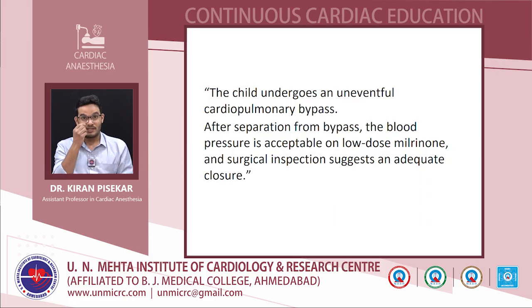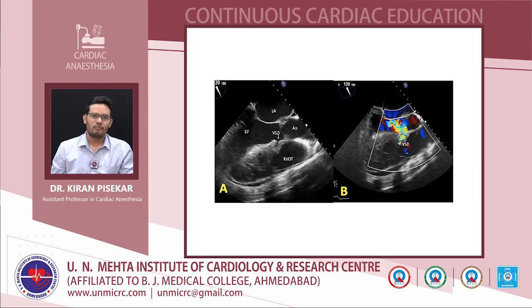Okay. Now let's assume that we have not inserted a TEE in this patient. Once the patient has come off, everything seems good and we are about to close and shift the patient. But in this patient we have inserted a TEE. This is the TEE. Now as you can see, after coming off we are assessing the TEE and we find a residual VSD. On top of that there is also aortic regurgitation along with the VSD.